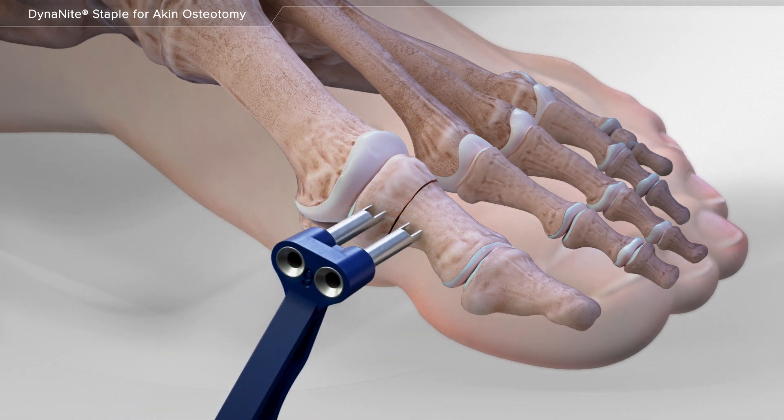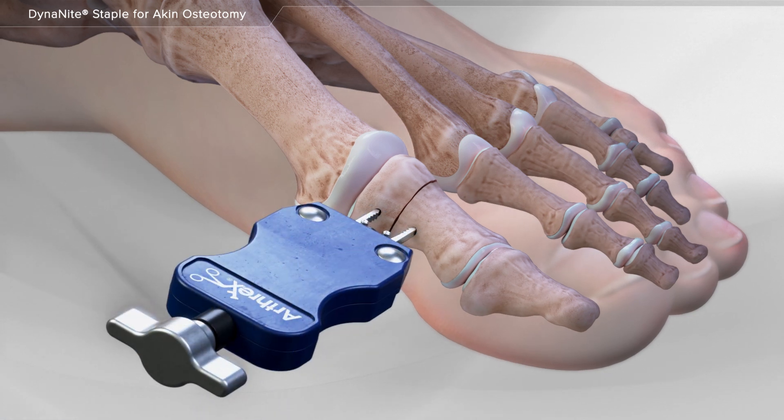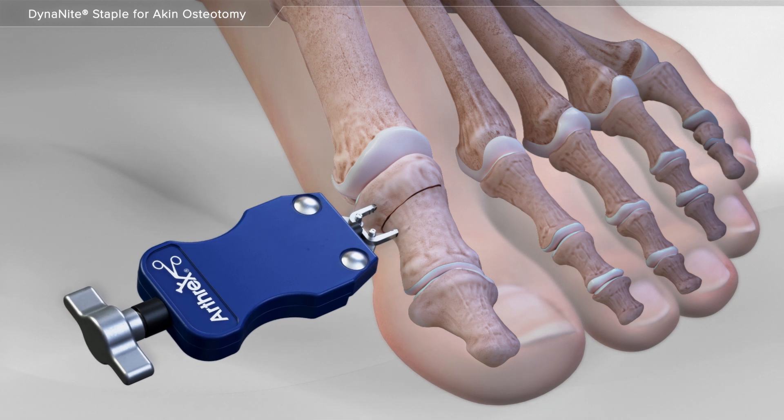Next, a series of special instruments are used to create holes in the bone. Then, the dynamite staple is placed into the drill holes and pushed into place.